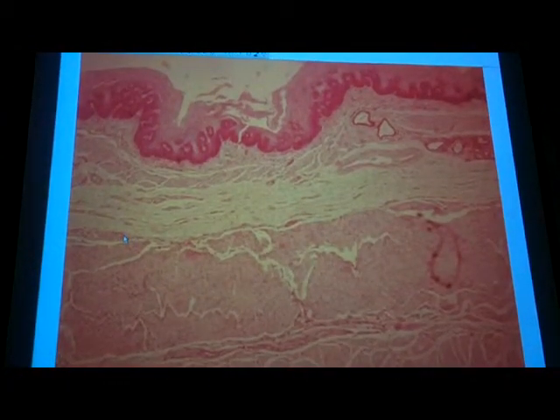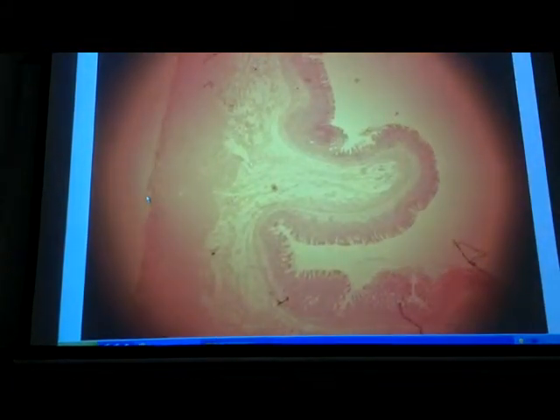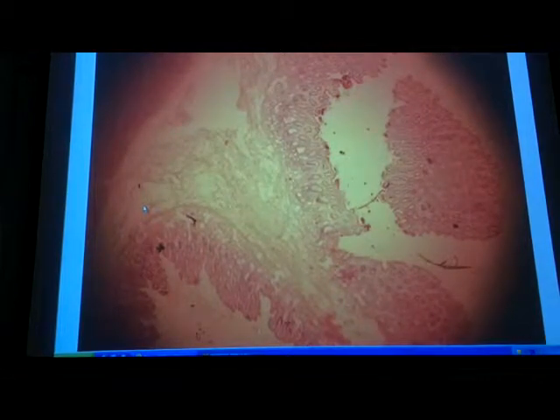Let's look at the stomach. The stomach has like 3 sections for the different regions, and you don't have to tell me, oh, this is the pyloric antrum, this is the body, this is the fundus. Don't worry about that. It's all stomach. That's all you have to know. So here's one slice. Here's another slice. There's one slice, 2 slices, 3 slices. Ah, there you go. So you got 2 here.